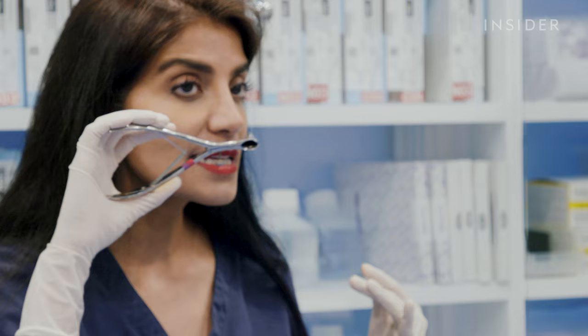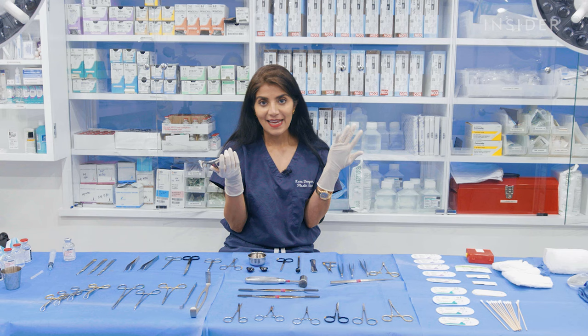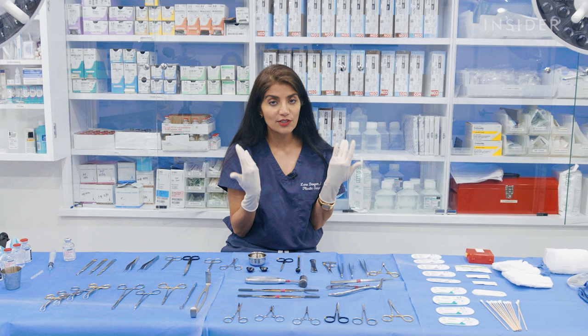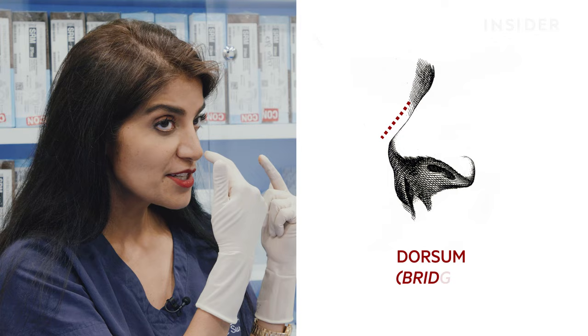And this goes inside the nostril and allows me to visualize what's going on the inside. And when we're looking at the nose, some of the things that I address aesthetically include issues related to the contour, the dorsum or bridge of the nose, and the tip. When someone has complaints about the bridge of the nose, often they're related to bumps on the nose.